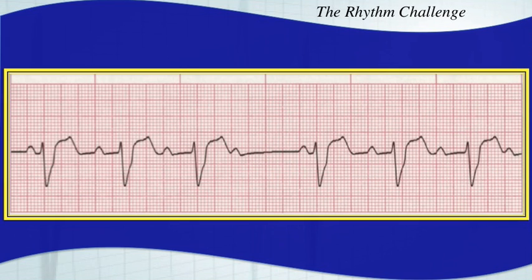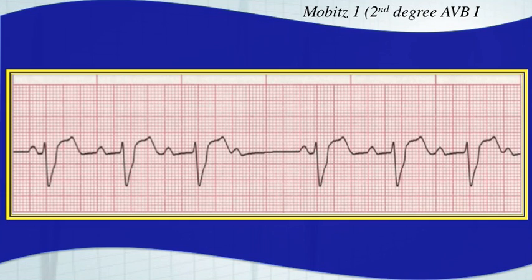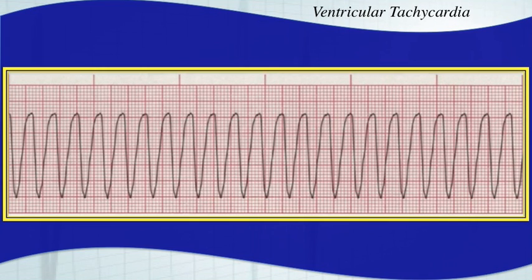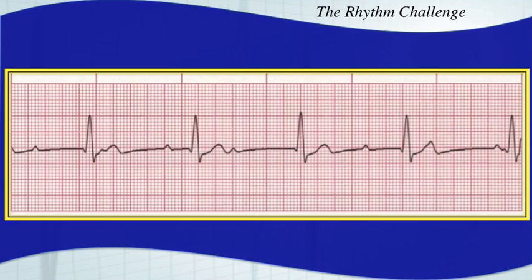This is a Mobitz I — a second degree AV block type I. You have that going, going, gone pattern. And this next one is a monomorphic ventricular tachycardia. They're all the same shape — very fast, very wide. You should be able to identify that instantly.